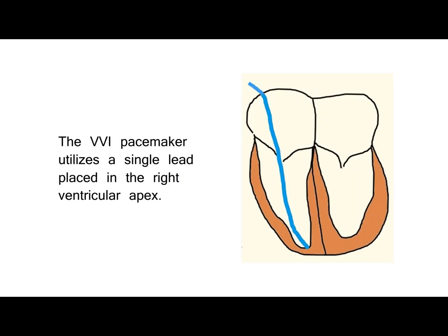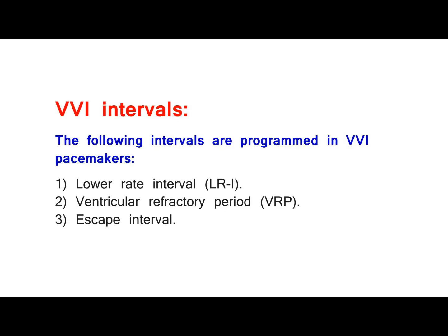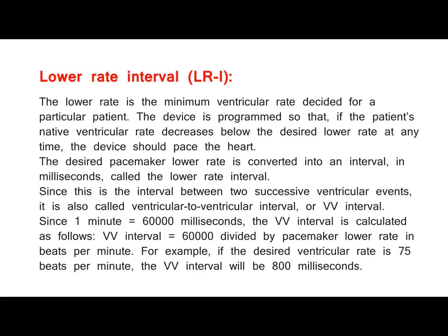The VVI pacemaker utilizes a single lead placed in the right ventricular apex. VVI intervals. The following intervals are programmed in VVI pacemakers. 1. Lower rate interval, LRI. 2. Ventricular refractory period, VRP. 3. Escape interval. Lower rate interval, LRI.